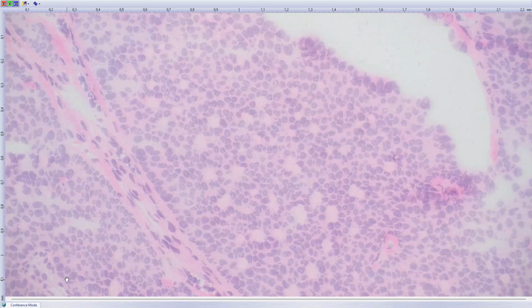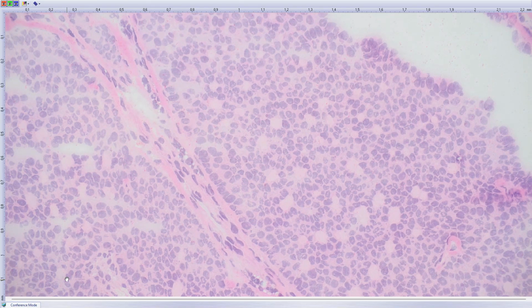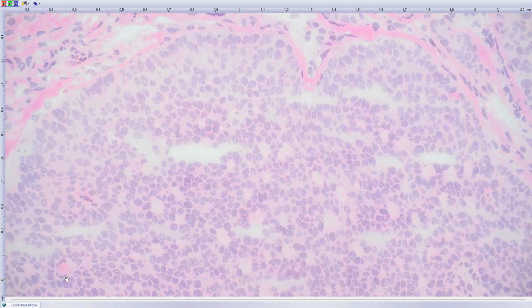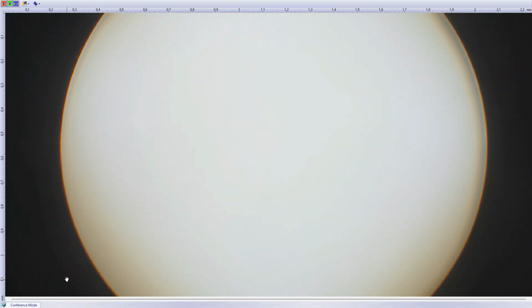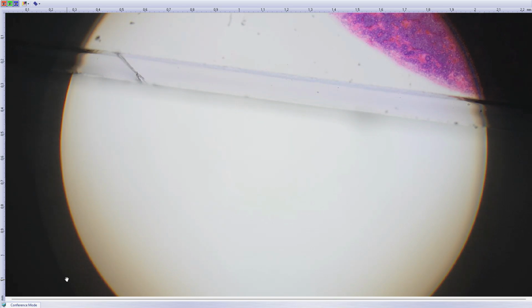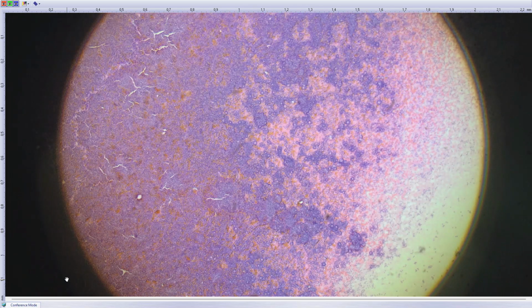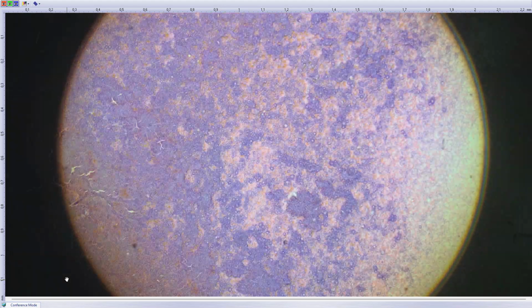Frozen section always changes the nuclear characteristics of the cells, and even benign cells may look quite angry because of these frozen artifacts. So what I always do, if it's possible, is cytology. In this case, you can scrape the surface of the lesion with the blade and then spread it on the slide like butter. This is what was done in this case.